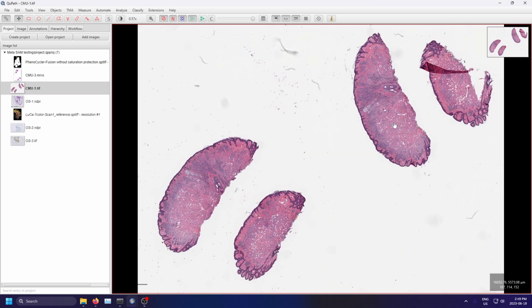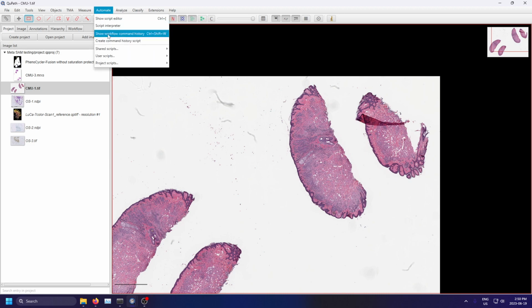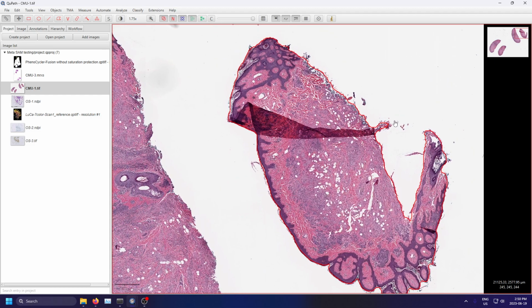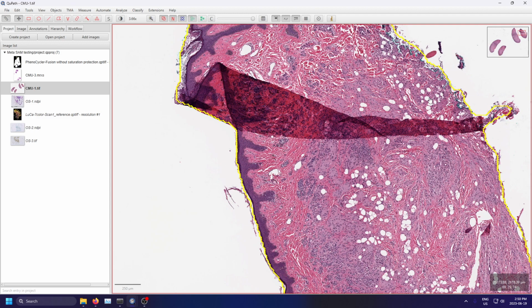Let's give it another go. Let's first detect tissue. Well, let's turn on SAM. Rectangle tool around tissue. Nice. Good job at segmenting it. And again, it's resolution specific, so depending on how far you zoom in, that's the level of how fine the annotation essentially will become.